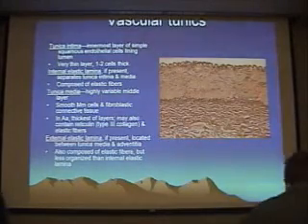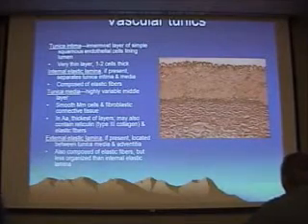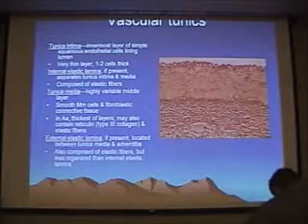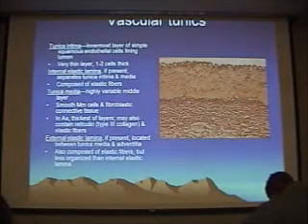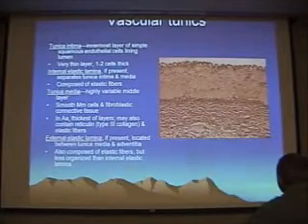The tunica media is mostly smooth muscle, but they too can have elastic fibers in it, and they show up very nicely in this special stain. And then we have an external elastic lamina — a little fuzzier, not quite as straight as the internal elastic lamina. And then lastly, an outer connective tissue tunica adventitia.